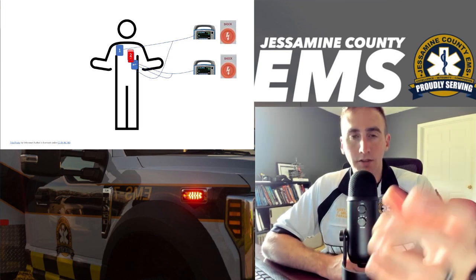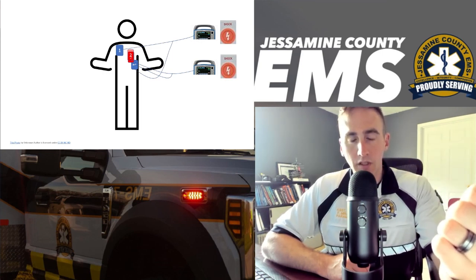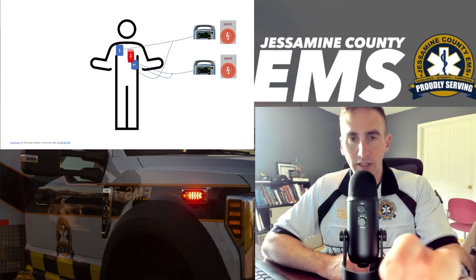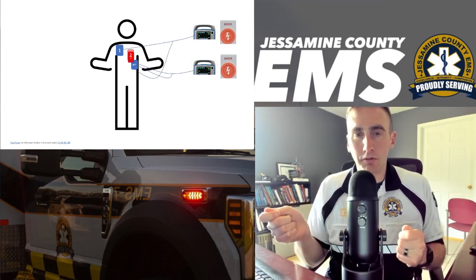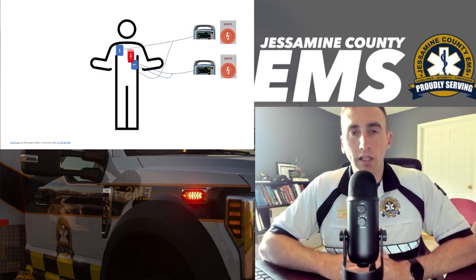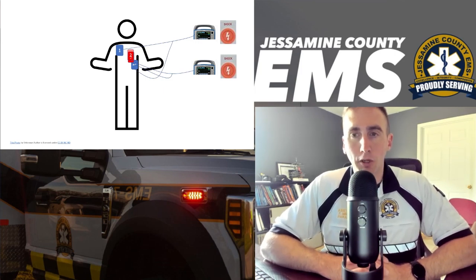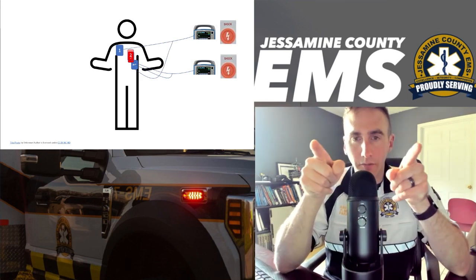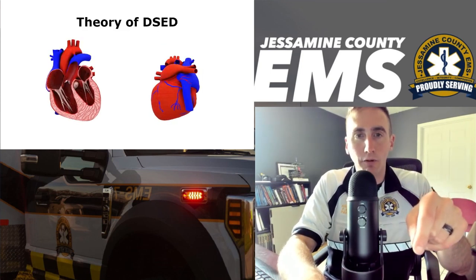What that is: using your standard anterior lateral placement, and then, like we would do if we're changing the vector, we put the pads on anterior posterior. But instead of pulling the cable and switching to a new set of cables, we leave both attached. We use 2 monitors and attach a monitor to each set of cables. We charge both to the max energy, and we hit the shock button. That is dual sequential external defibrillation. When I say sequential, I mean the second shock comes about 1 second after the first shock.